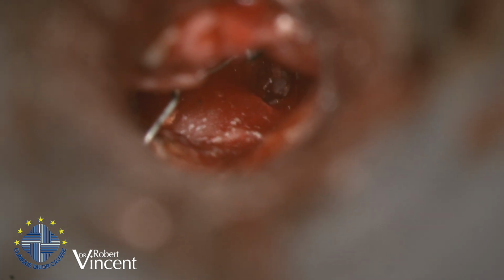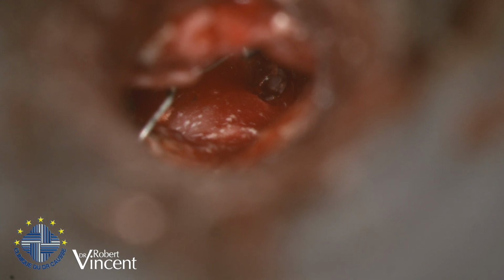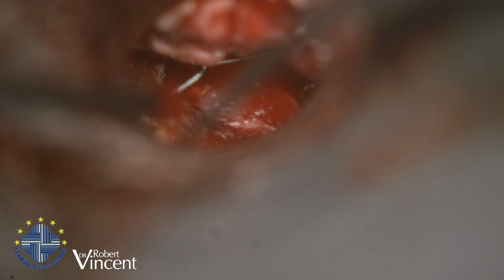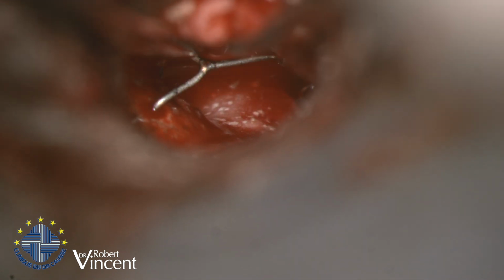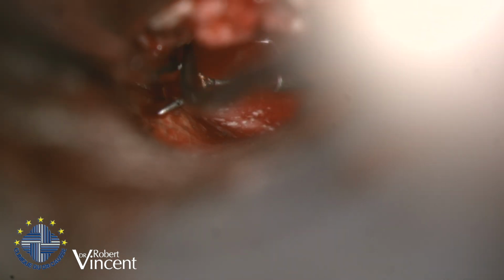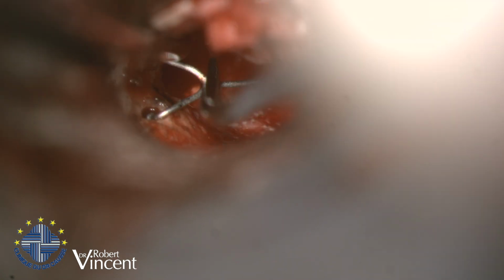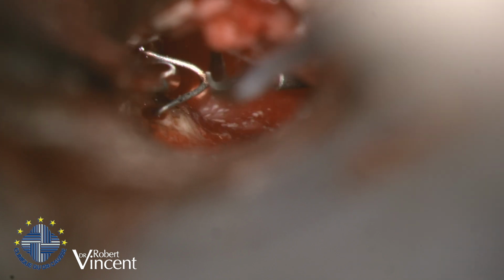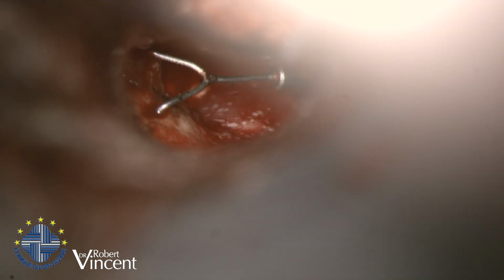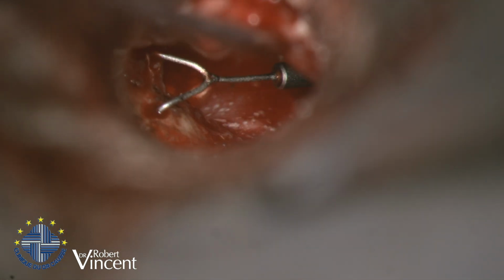So then, second step, I will do stapedotomy and do a Malleus to stapedotomy procedure. How long would you leave it? 6 months. 6 months is better. No, 3 is not long enough. We have a lot of scarring. Yeah, sure. Because you know, this will be fixed. At the moment, it's still too much mobile, a little bit loose. But after 6 months, it will refix to the bone, and it will be fine.